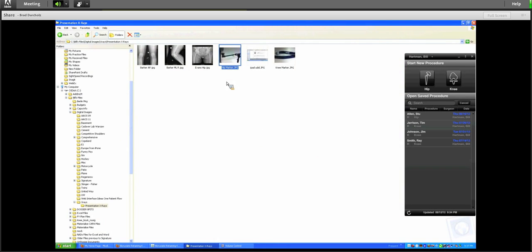It's also able to run on an iPad. During this evaluation, we're going to want people to pull these up on the iPad. The icons, when you log on, I don't have a real good way of screen sharing an iPad with you right now, but you will very easily recognize the same list, the same format, the same color as what you're seeing on the sidebar. To be able to pull up cases, you would double click the case and it would come up onto your iPad.